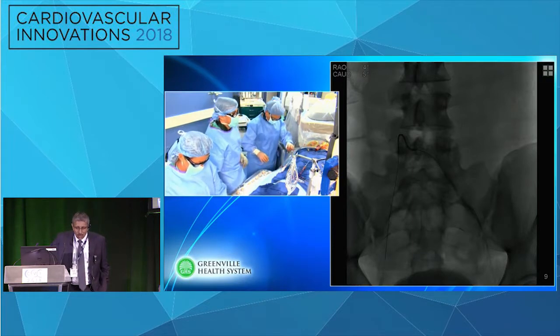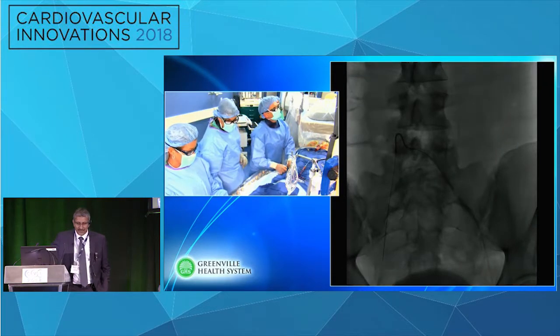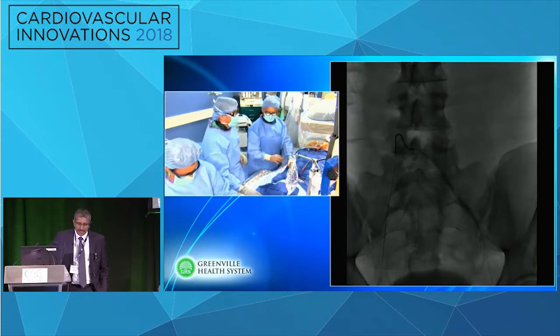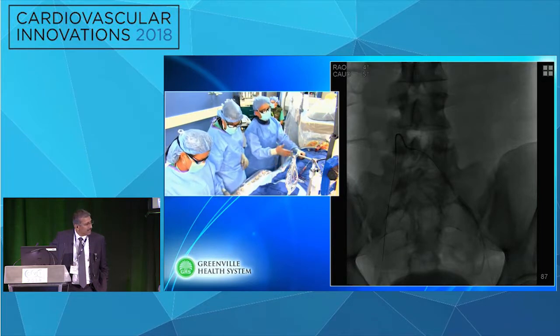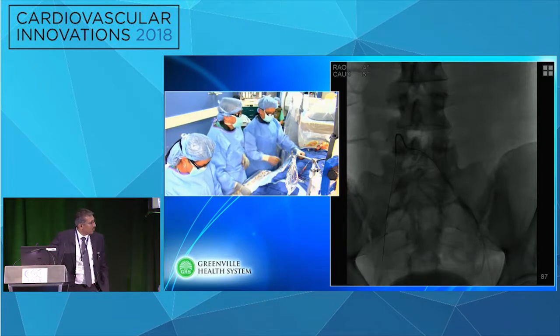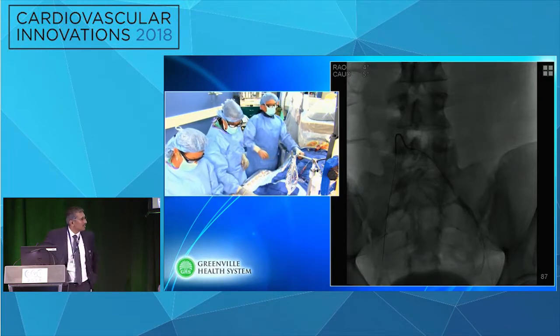Just as your thought, how low do you want to stent this? Well, that's going to be the big question I had from the start as well. On the CT, it looked like the common femoral vein just to the inguinal ligament would be good enough. That's why I thought accessing that left groin over there was not going to be a big deal. Anyone in the panel has a comment on that? How low would you stent, or would you cover all the way? I agree with Bruce.